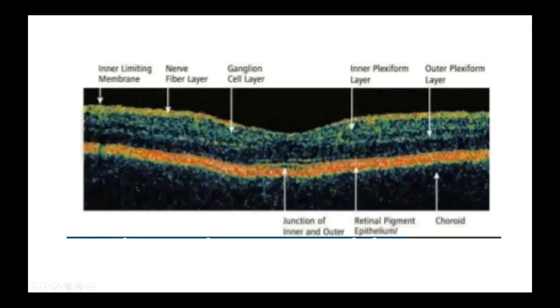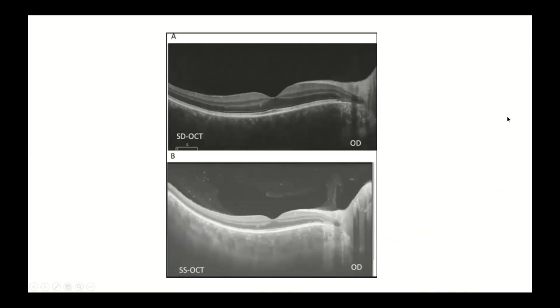In a larger image, the RPE cells and nerve fiber layers are quite reflective and appear red, while the vitreous and photoreceptors are rather dark with low reflectivity. Structures in between — like the inner and outer plexiform layers — appear green.